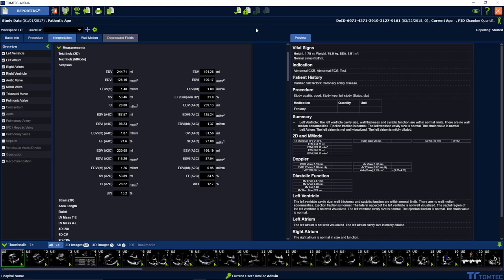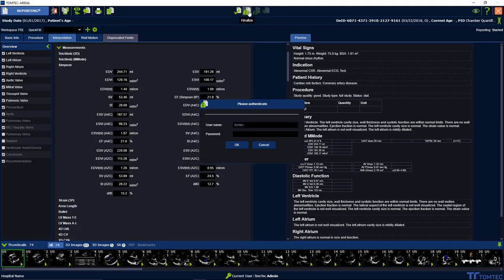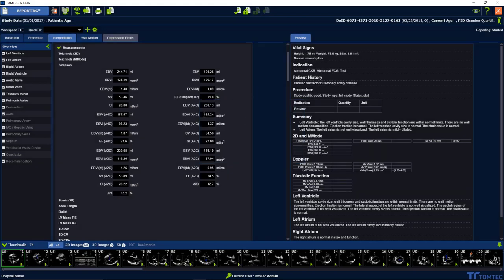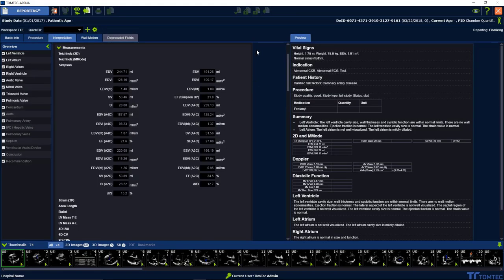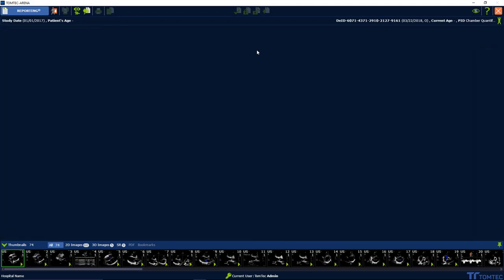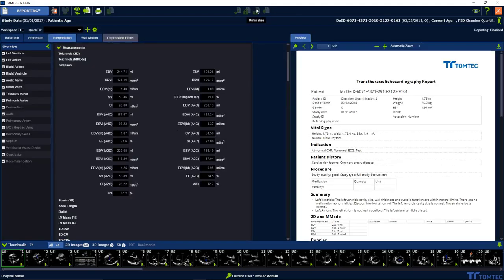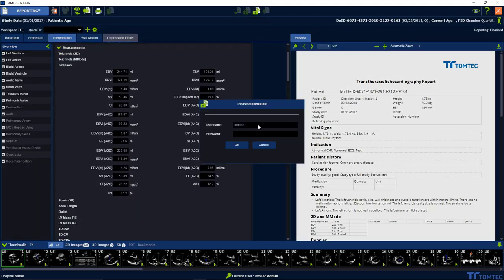Once we have finished our work, we can finalize the report. To finalize the report, please insert the password and go for OK. The icon next to the right lets us unfinalize the report if the report is already finalized.